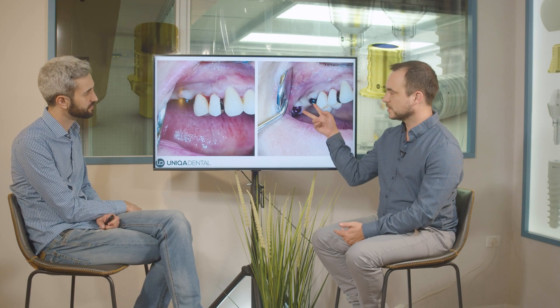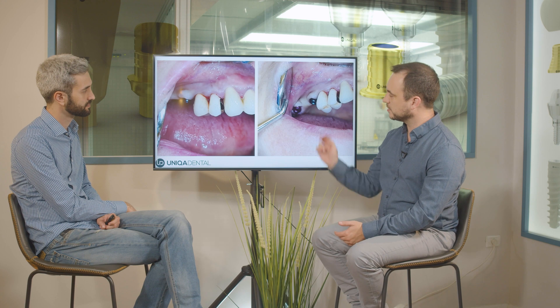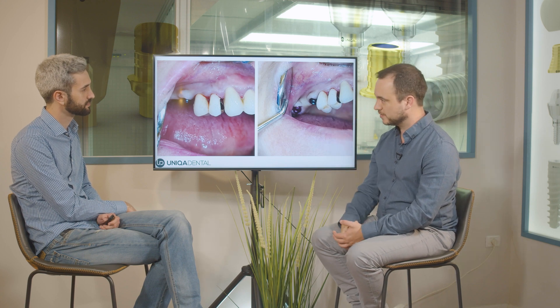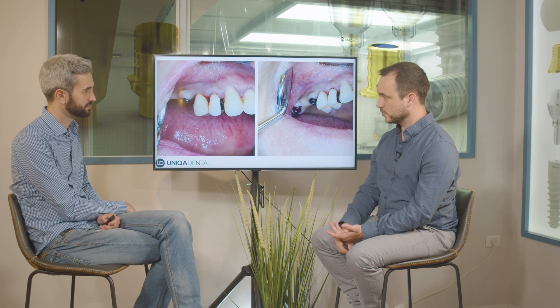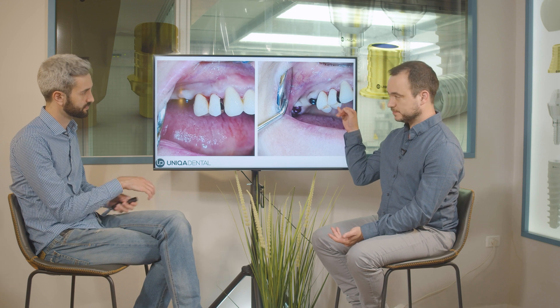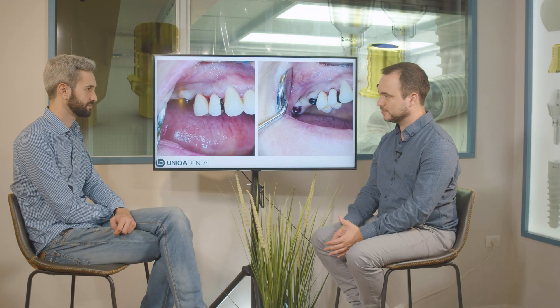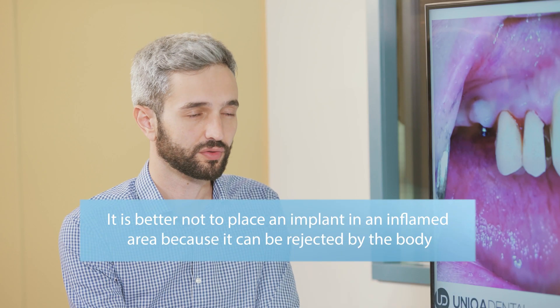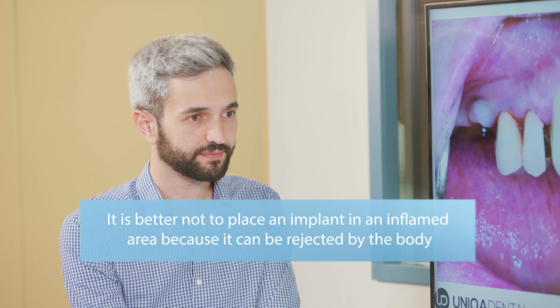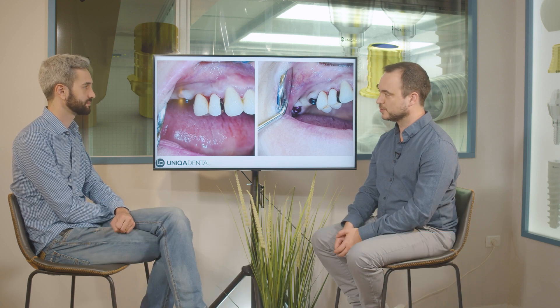We have two implants, we cut the bridge between 13 and 14, and we extract the tooth with the pontic and with the crown — all at once. The implant we'll place will be instead of tooth 14. We don't want to place the implant inside the socket because you had an inflamed tooth there — you don't want to place an implant in an inflamed area. You need it to heal first.